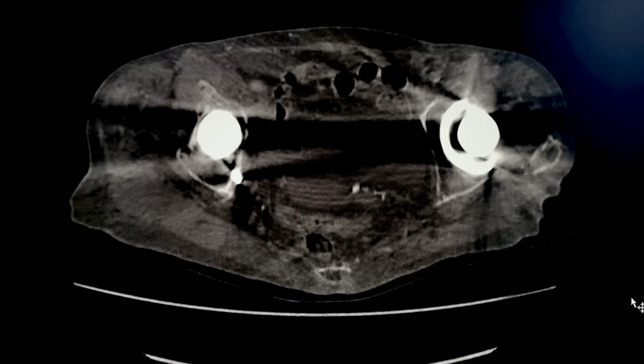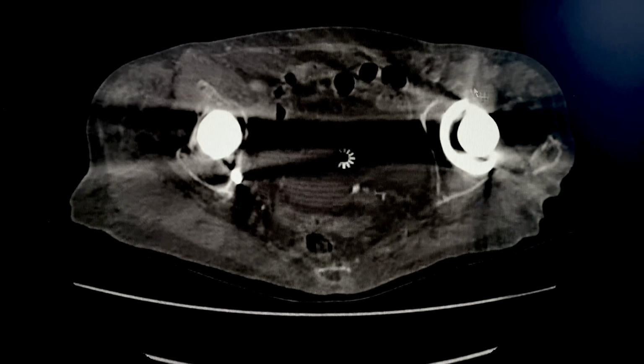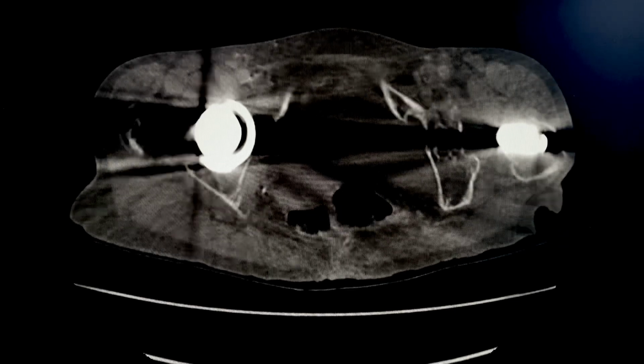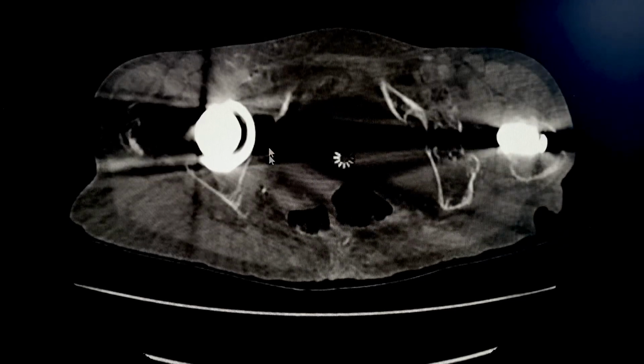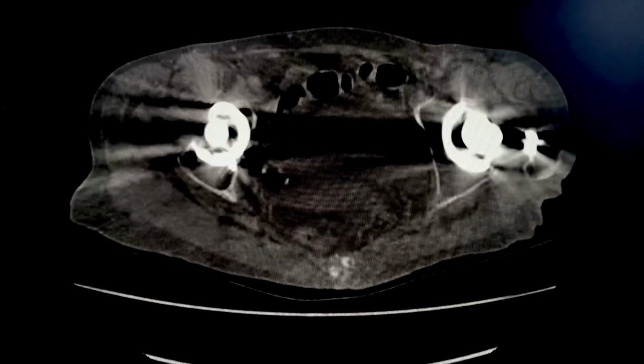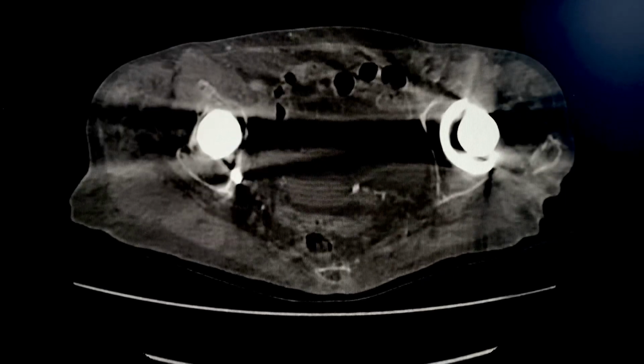Now, as we can see, this patient had endoprosthesis of the left hip joint replacement. The patient had a hip replacement on the left as well as on the right. All right, so you can see the titanium metals. But now our concern is the blood vessels. We are looking at the common femoral artery on the left as well as on the right.